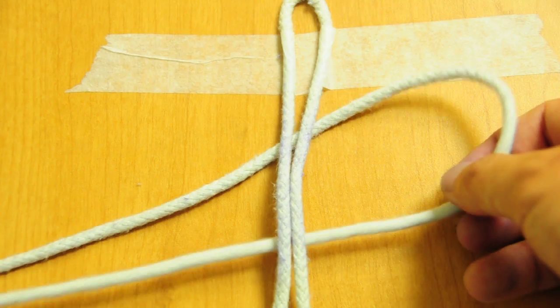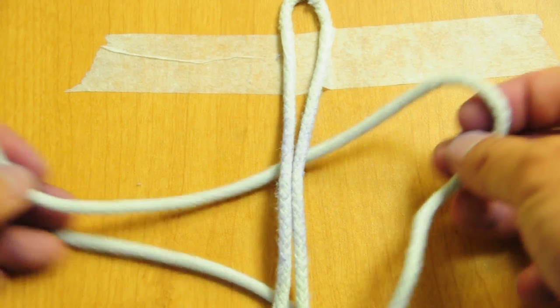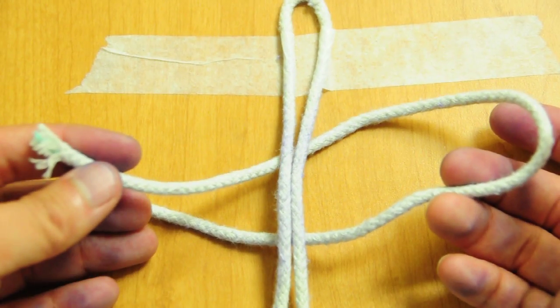So what happens is you leave a loop here, kind of like this, and a free end like this, and you're going to be tying the two together.